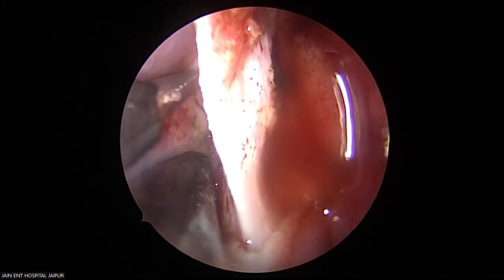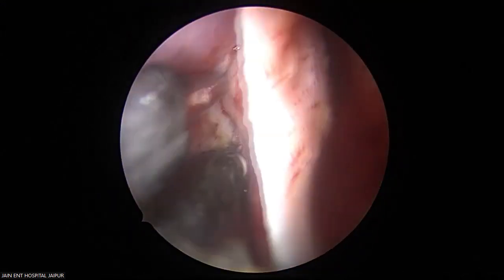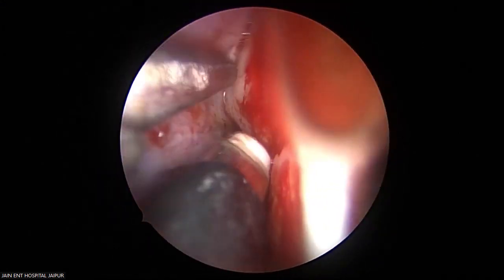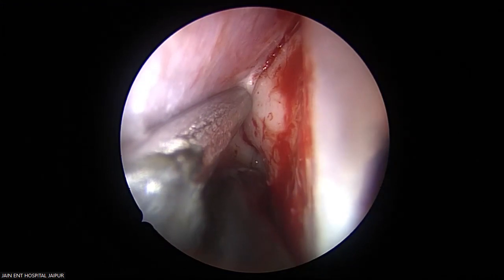See, this is the periosteum which I am coagulating. ENT surgery has become a game of power instrumentation. Yeah, instrumentation has a big role. Yes, sir.